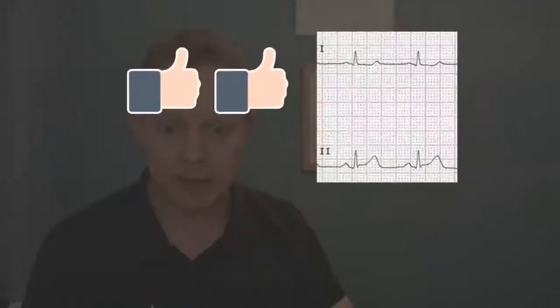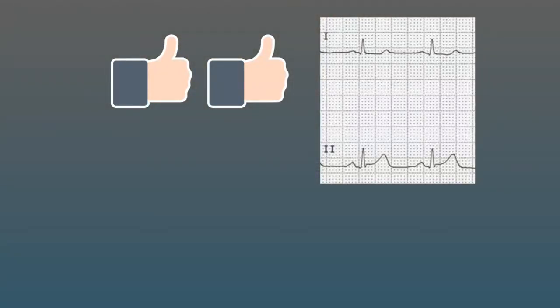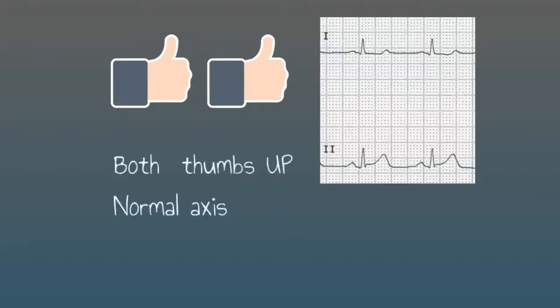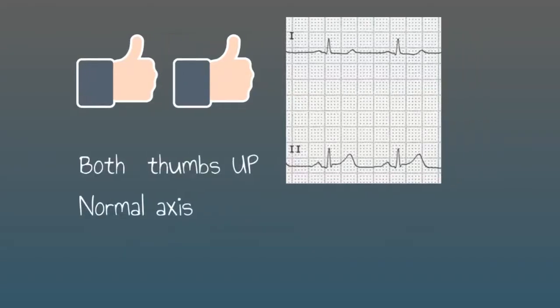Let's have a look at how we use that to calculate the QRS axis. Here we've got lead one and there's an R wave, there's no S wave - it's predominantly upwards so our left thumb goes up. Lead two, again you've got an R wave, there's no S wave, it's predominantly upwards - put your right thumb up as well. And that means we've got a normal axis; both thumbs are up.